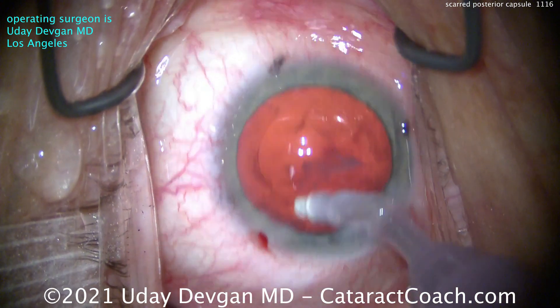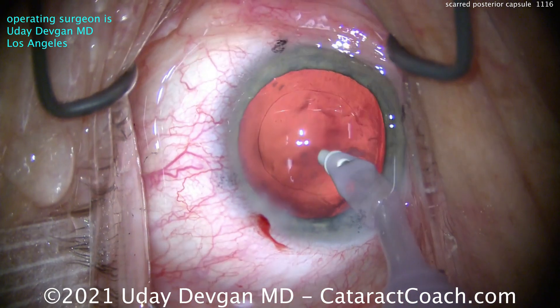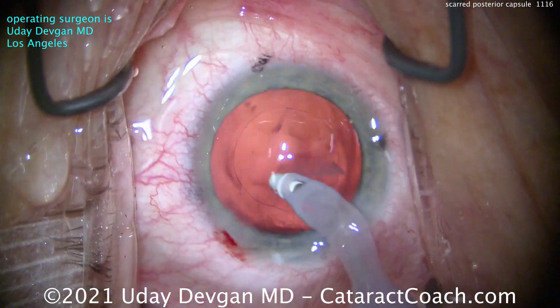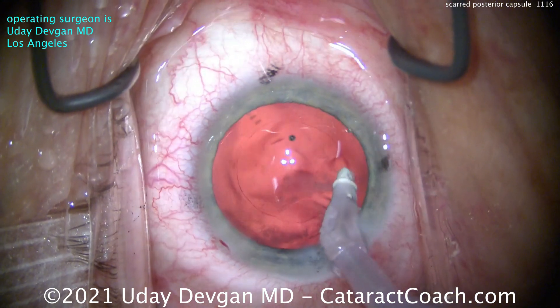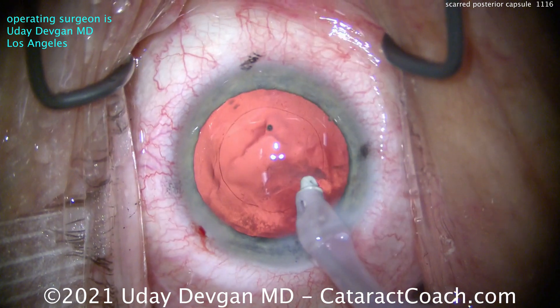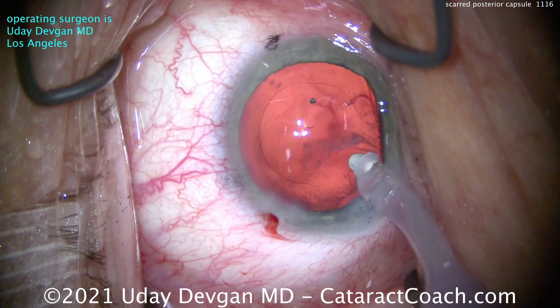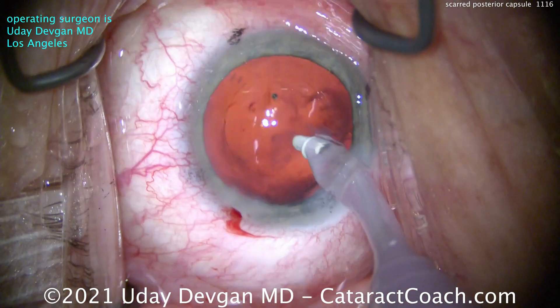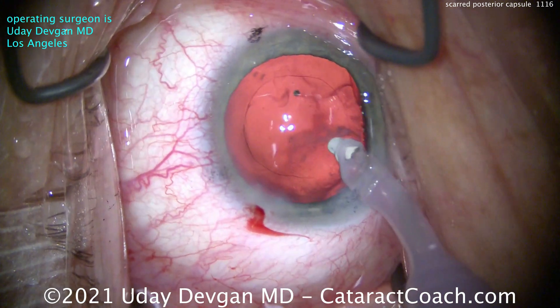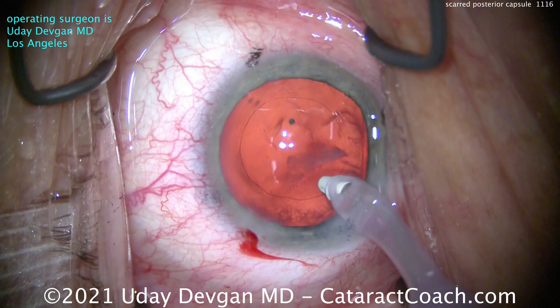Cleaning up the capsule bag here — doing a little polishing on the undersurface of the anterior capsule rim. I really want to get this nice and clean. I'm using the polymer tip on the I/A probe — you can see that white tip — trying to vacuum it. You can use a polish mode on your machine or use regular vacuum mode and titrate the degree of suction with your foot pedal, which is my preferred technique. Sometimes you can get an edge and scrape it off, but I'm not sure if I'll be successful.